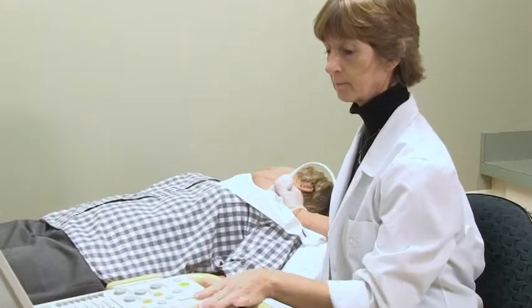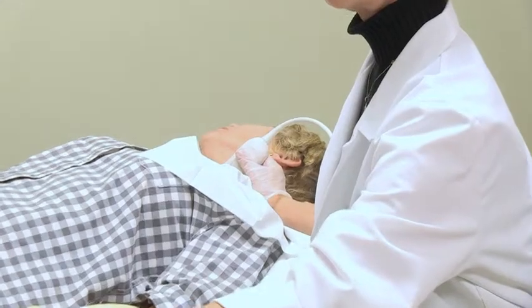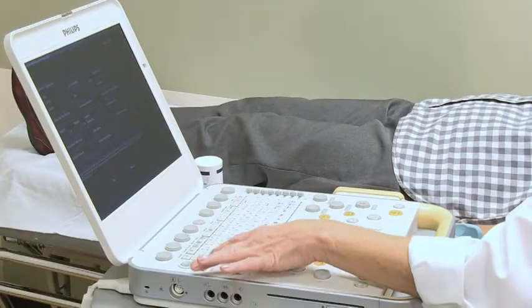You will hear some swishing noises as we measure the blood flow. This test is painless and will take approximately 20 to 30 minutes.